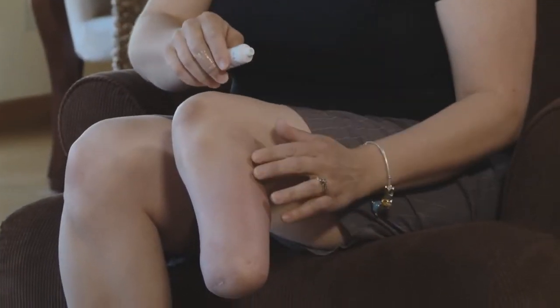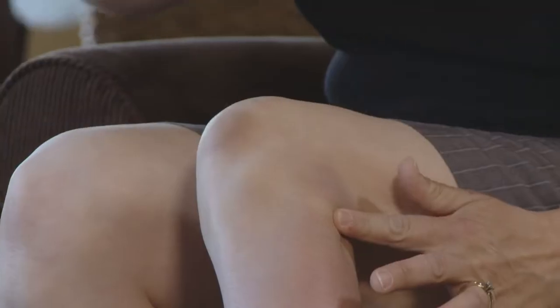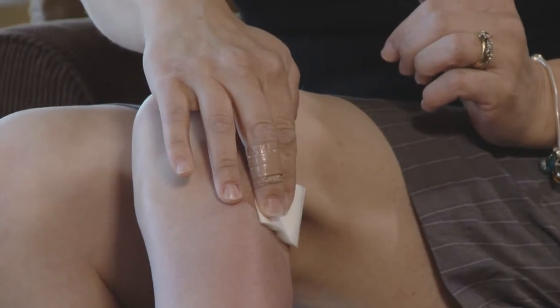If you have any areas on your limb that require the application of medicine, be sure to cover the medicated area with a gauze patch before applying the liner.